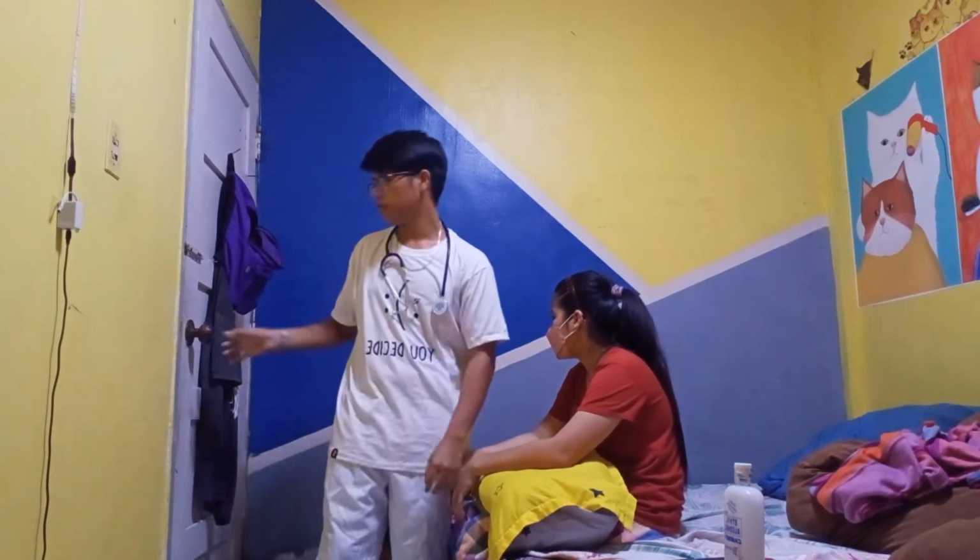And next is wash hands. So rationale is reduces transmissions of microorganisms. So next is draw curtain around bed and close the door. So, to maintain client privacy. So wala tayong curtain.